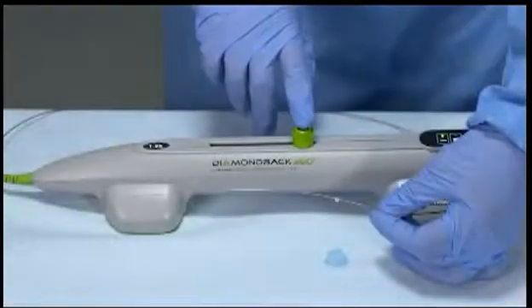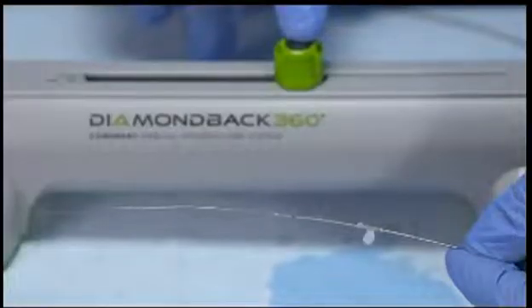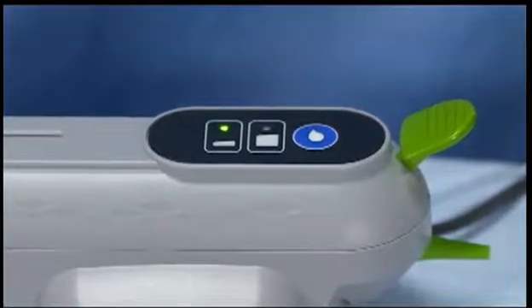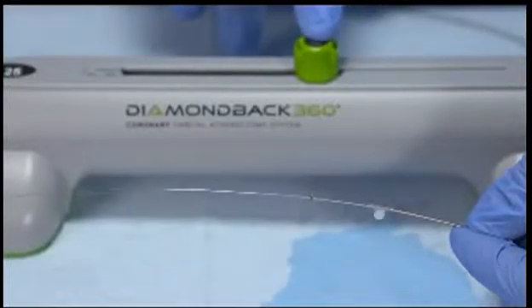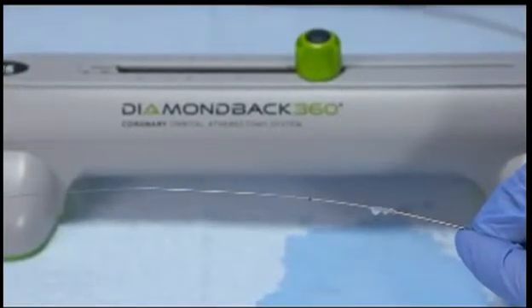Press the on-off button located on top of the crown advancer knob to activate crown rotation. The OAD is preset to low speed and the LED will indicate that low speed is selected. Check that the flow of saline has increased and that the shaft and crown have begun to spin. Immediately press the on-off button again to stop rotation and complete the test.